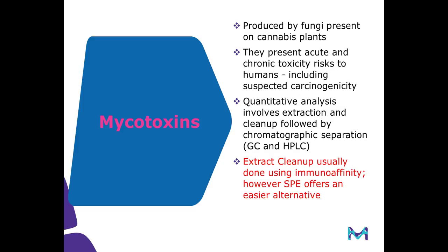So the last topic I'm going to talk about is mycotoxin testing, and this is a realm of testing that's not quite as common as the other things that I've talked about, but more and more we're starting to see that states are requiring this. I do believe that California is going to require this. Now, mycotoxins are produced by fungi that are naturally present on the cannabis plants. The thing is, though, that mycotoxins are toxic to humans, and some are suspected of causing cancer.